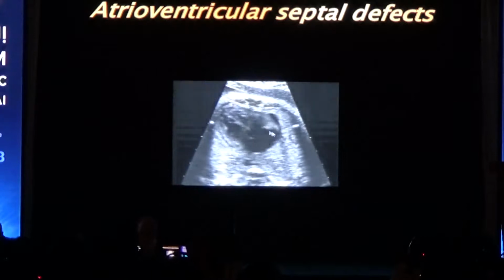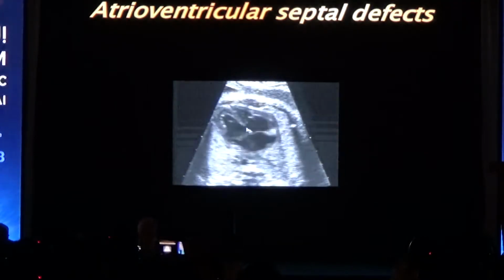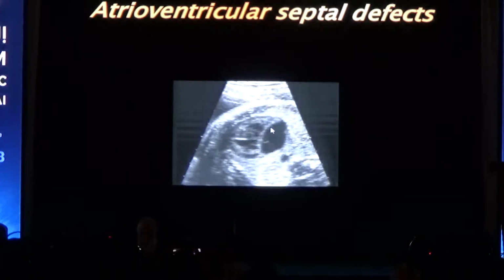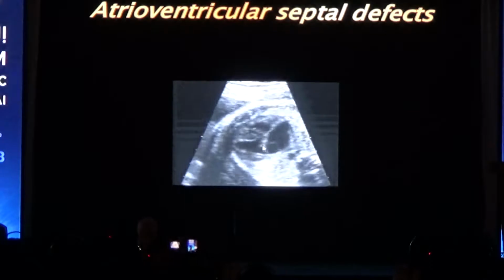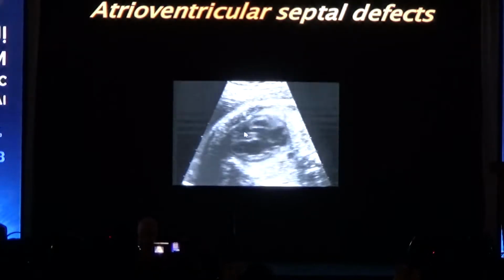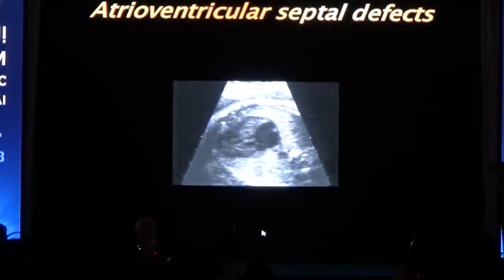ventricles. Another example over here, you can see a large common atrium, you can see a large interventricular septal defect, and you see the membrane, you see the anterior leaflet, which is attached here to the right side and the apex of the septum. Again, Rastelli type A.